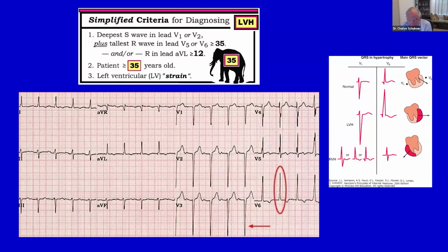One thing about taking an EKG is that I was in the practice of taking a standard 12 lead ECG and then a rhythm strip. Now, if there's normal sinus rhythm at a normal rate on the ECG, you really don't need a rhythm strip. But if there's anything abnormal about the rhythm, it's very helpful to look at a longer tracing than just the one page.